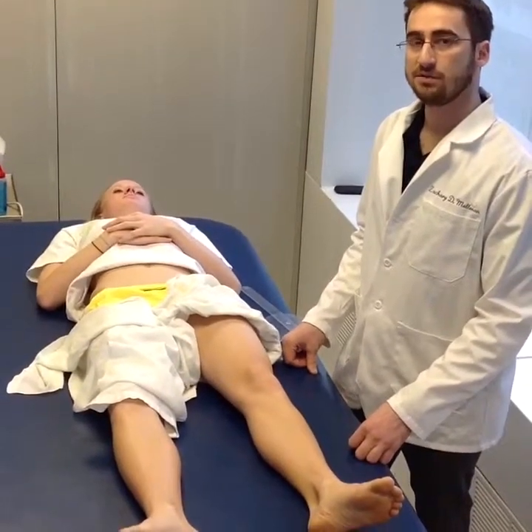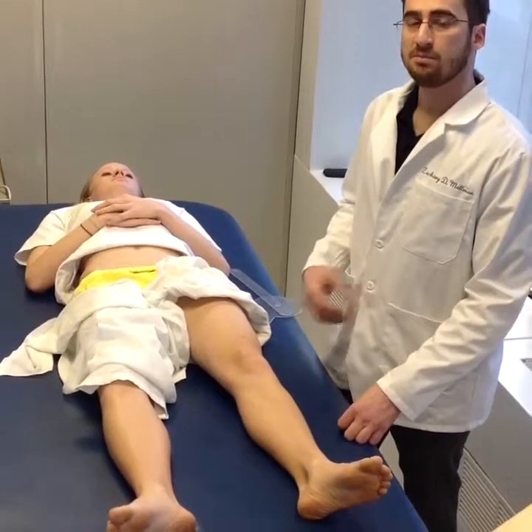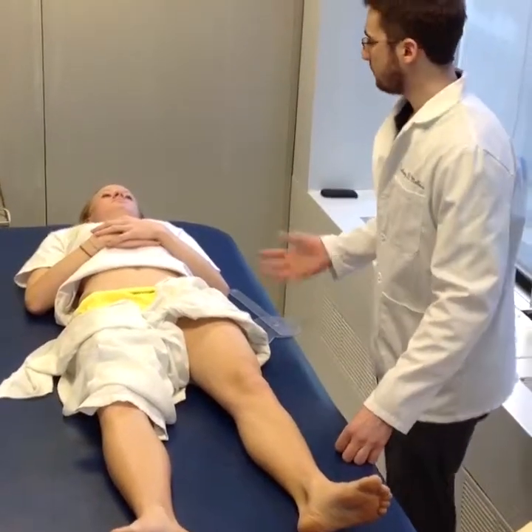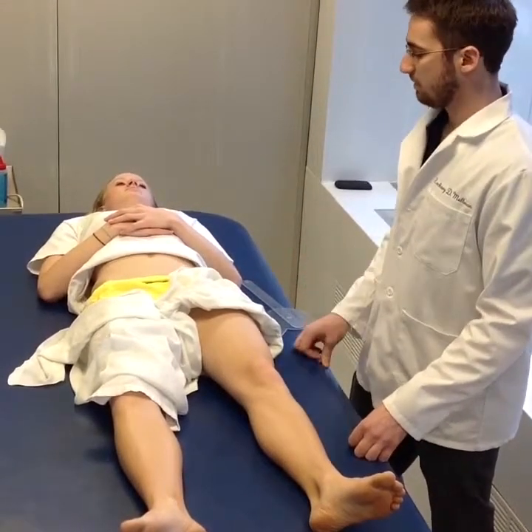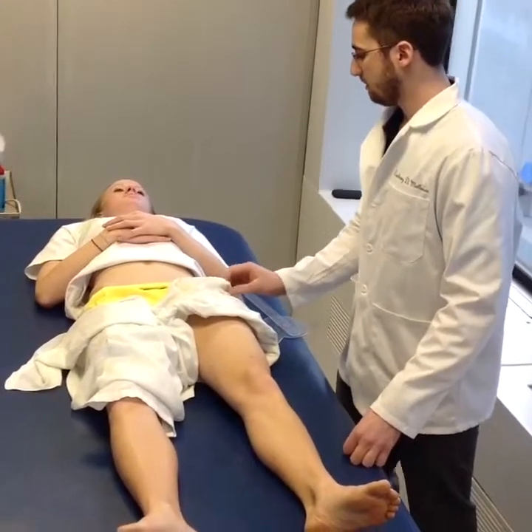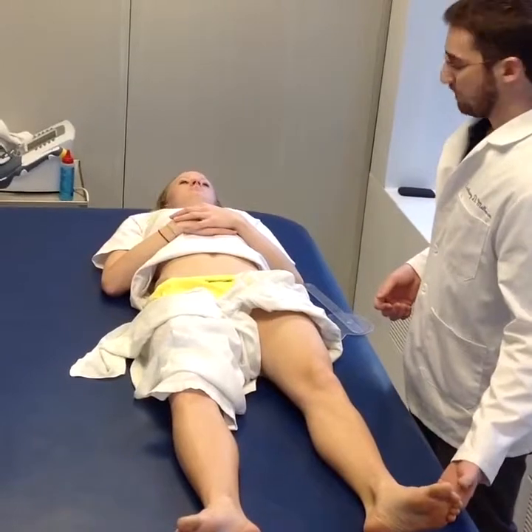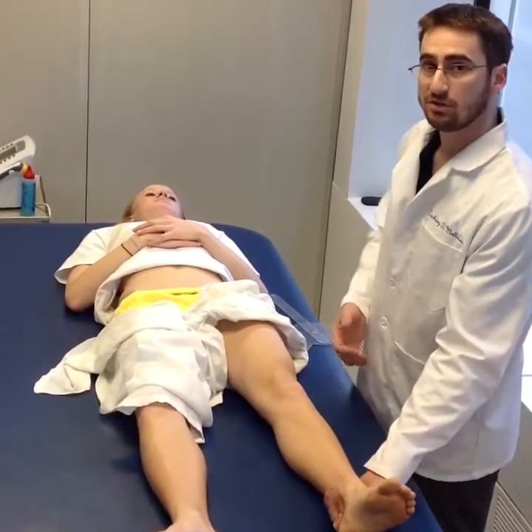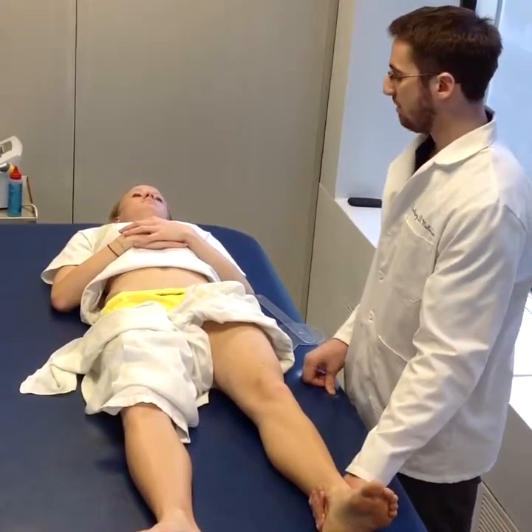Now that we've done active range of motion, we're going to move into passive range of motion. The real difference here is we're not going against gravity, and I'm going to be producing the movement. As you can see, we have Alyssa here in supine, draped, and I can see her ASIS. We're going to be grabbing the ankle just to make sure that there's no rotation so we can keep her leg in neutral — so no compensations.